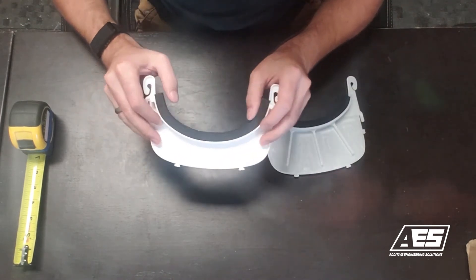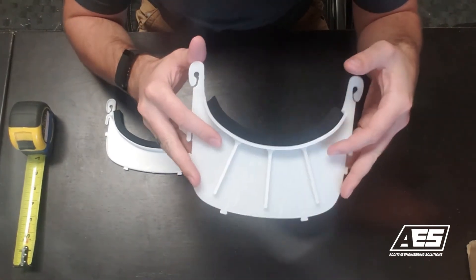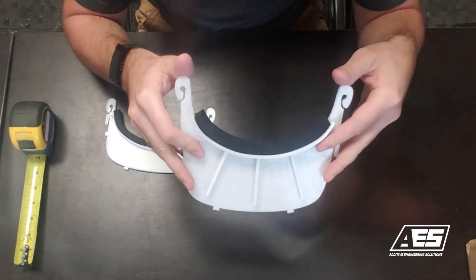So again, the standard one will work with loops, just not with the light. This one was designed specifically with dental professionals in mind to work with loops and their light.